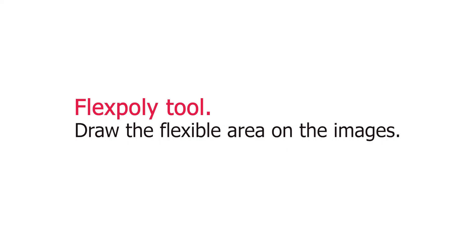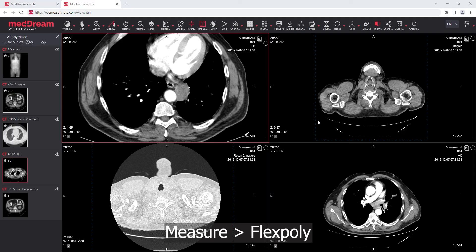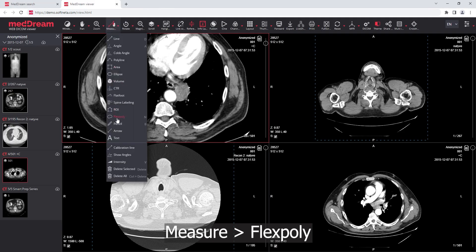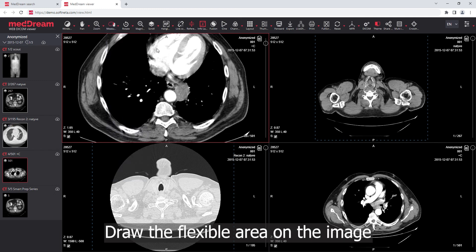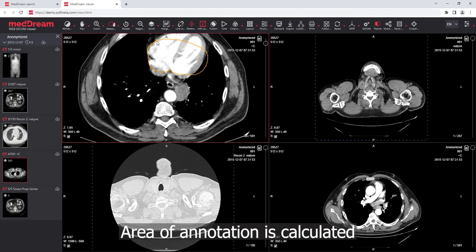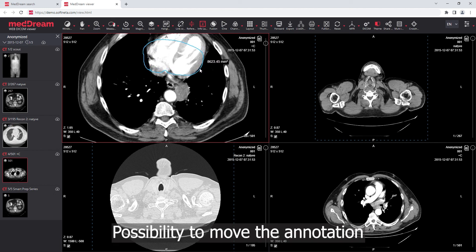FlexPoly Tool: draw a flexible area on the images. The area is calculated automatically. There is also a possibility to move the annotation.